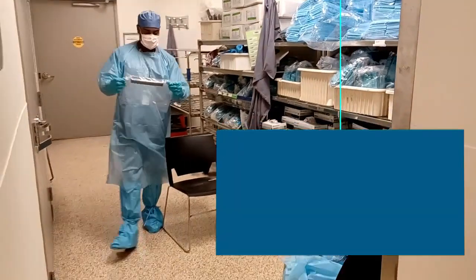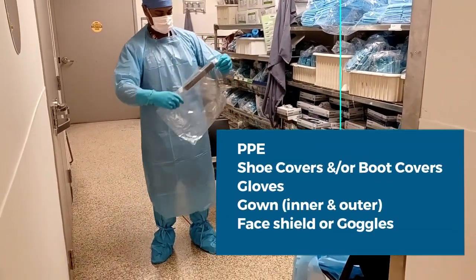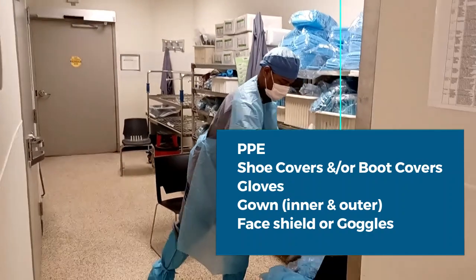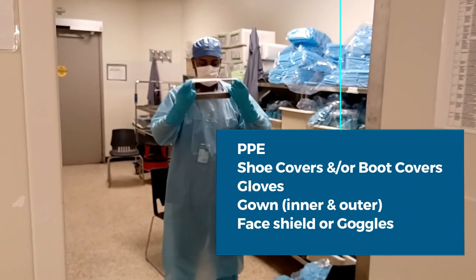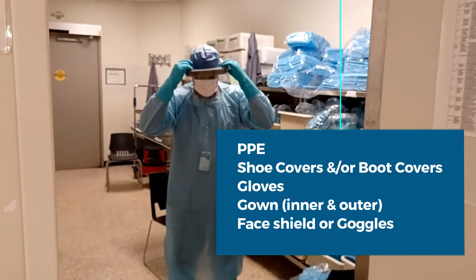Last, you want to apply a face shield. This helps to protect you from any fluids that may splash during the decontamination process.